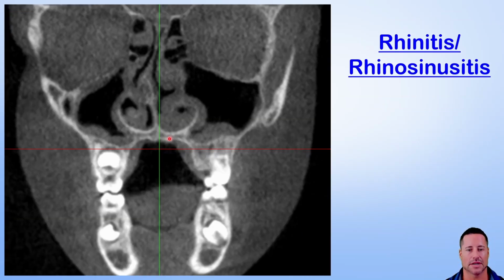Another example of rhinosinusitis. And look at the asymmetry in the sinuses. And this isn't an old patient. Look, we've got the premolars developing. We've got that high vaulted palate, insufficient tongue space, obstruction in the nasal passageways, chronic breathing issue.